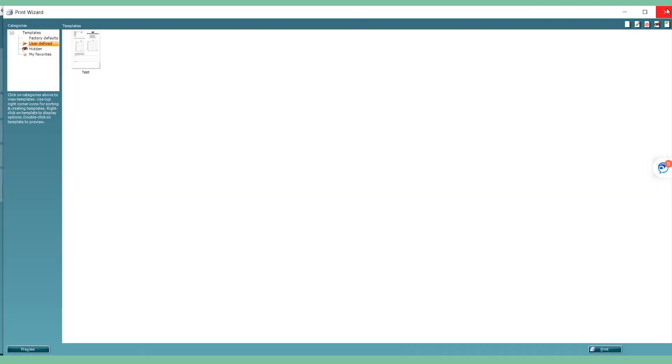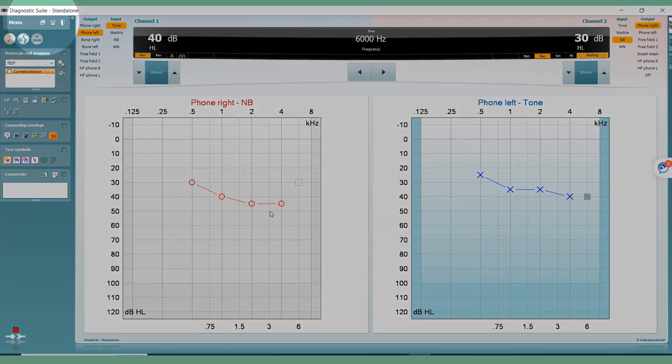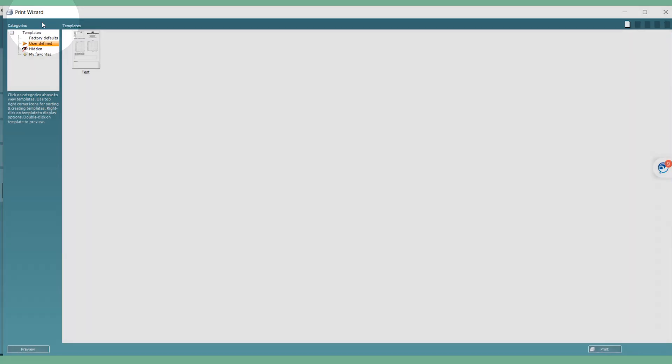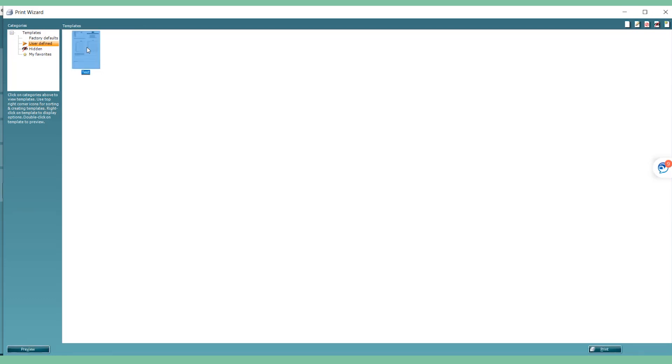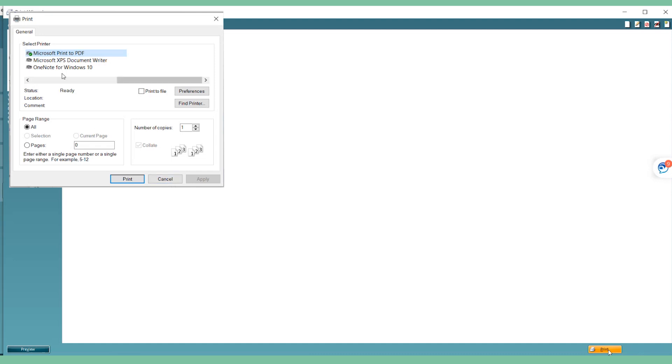To do this, complete your test and click on the printer icon. The print wizard will open. Pick your desired layout and select Print. The printer used will be the PC's default printer. You can also select another printer, such as the hardcopy printer or a PDF creator.